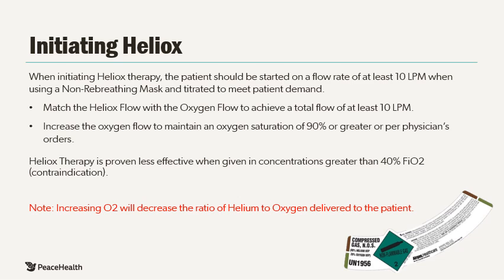Heliox is proven less effective when given in concentrations of greater than 40% FiO2, which is a contraindication here at Peace Health. So keep note, increasing O2 will actually decrease the ratio of helium to oxygen delivered to the patient.